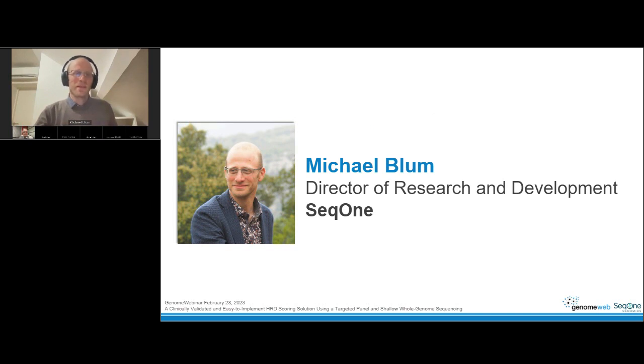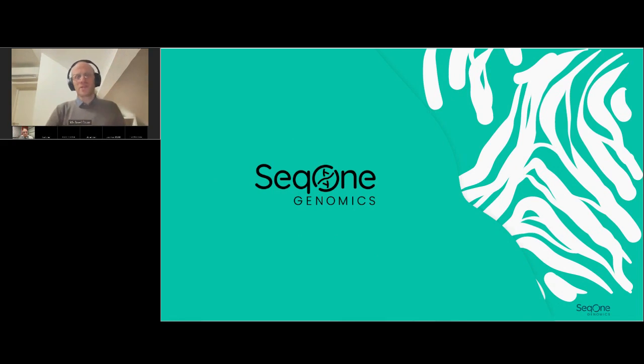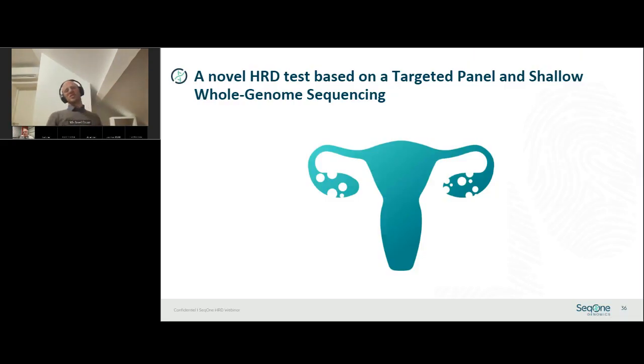Genomics. So it's a new test which is based on two assays, a targeted gene panel and shallow whole genome sequencing.